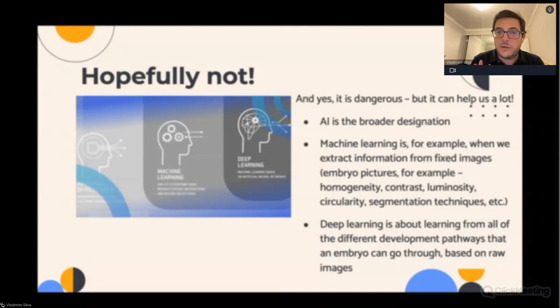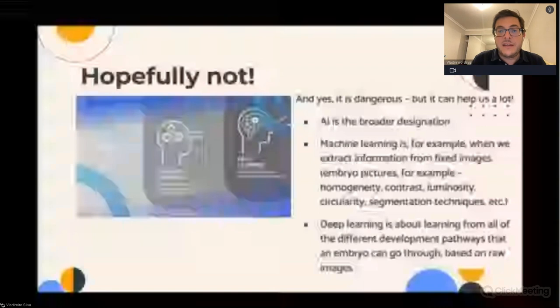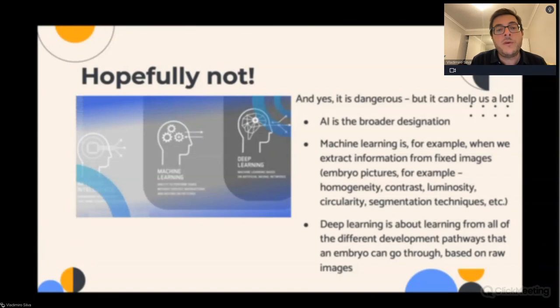So this means that right now I still trust embryologists more than I trust the machines, but it's progressing a lot, and it will help us a lot. Why is that? Because we are humans, and there are things that the human eye cannot see, and there are so many aspects in the analysis of a developing embryo that we just can't see, and so it's preferable to rely on machines that have a much more powerful and systematized way of looking into things. Machines don't get tired, machines don't have personal problems at home. They are always focused, always reproducible, and with these new technologies, they can learn. And that's why we call it artificial intelligence, because these machines can learn.